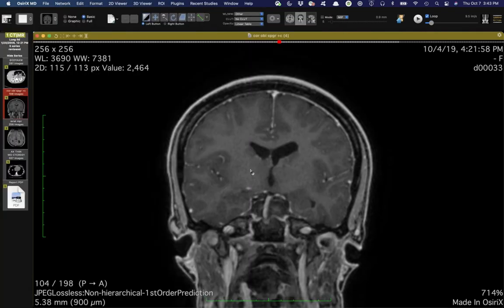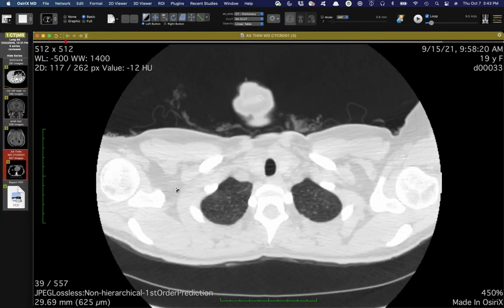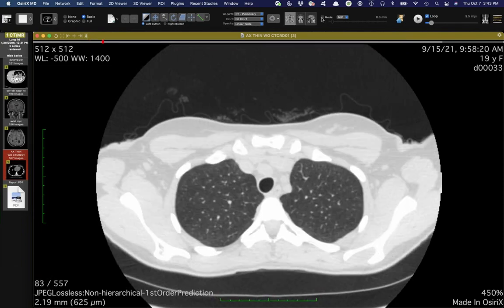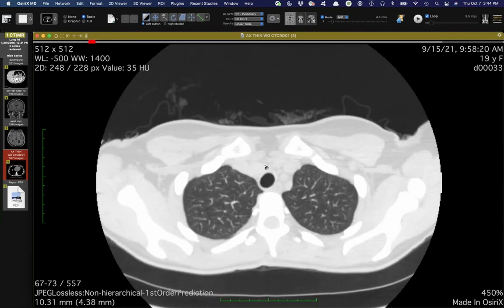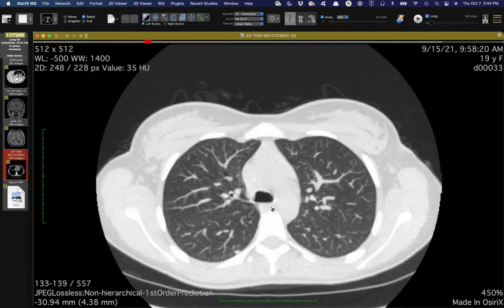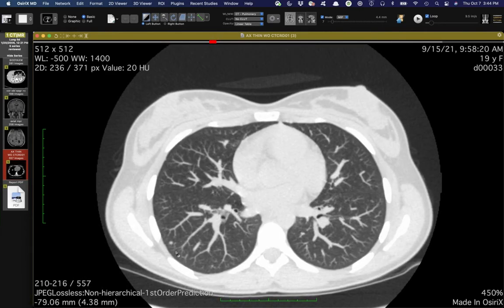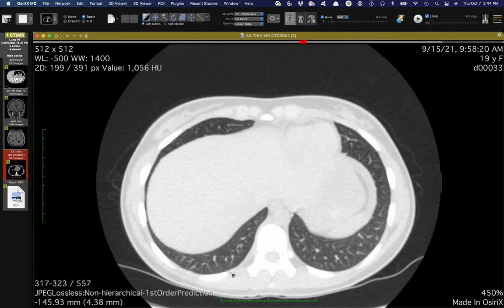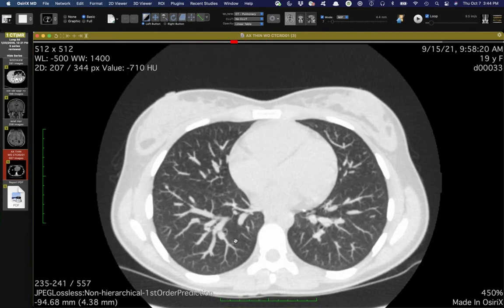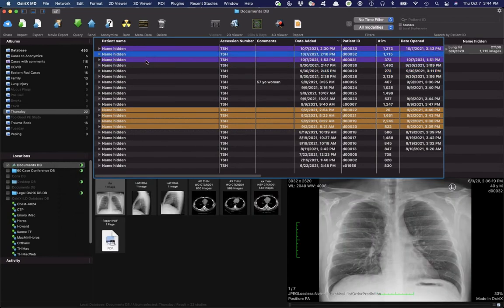Travis, if you display the lung and make it a MIP, does she have any discernible tiny nodules in the lungs? Not really. I'd give her one little juxtapleural lymph node there. These are nondescript, probably just little intrapulmonary lymph nodes. But yeah, lots of other manifestations of tuberous sclerosis complex.